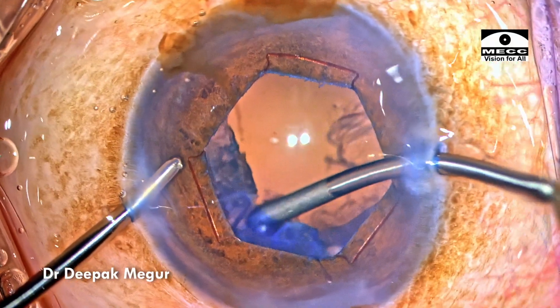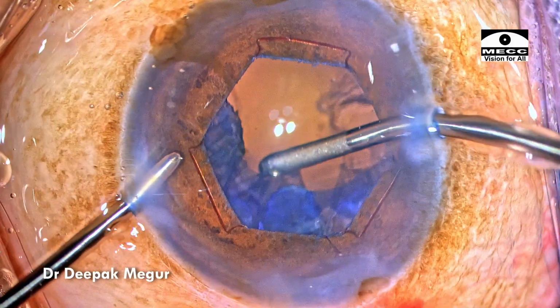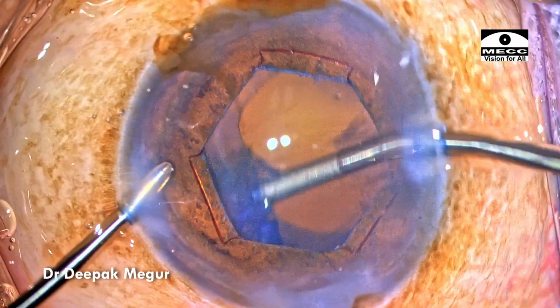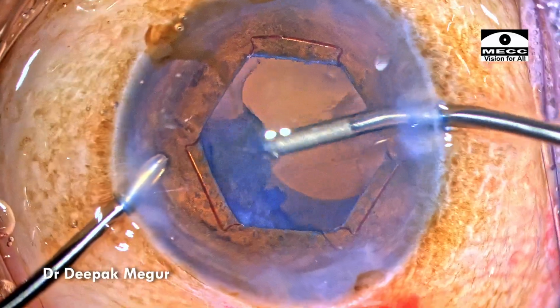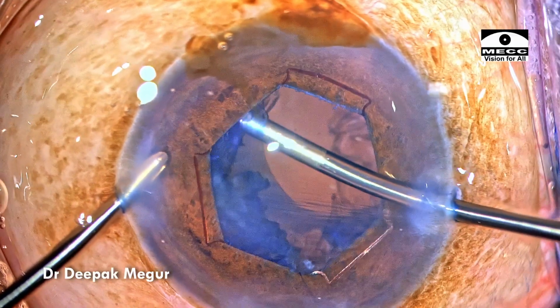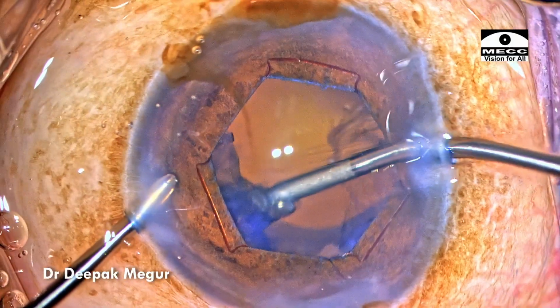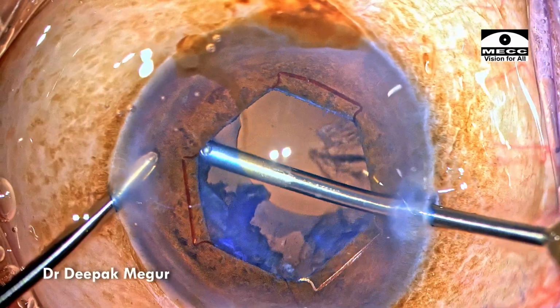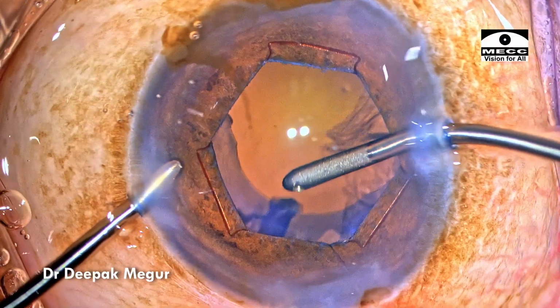In these cases, because the laxity of the zonules is such that we can never achieve a good cortical cleaving hydrodissection, the cortex tends to be very sticky to the capsular bag, and to add on, we also have a CTR inside. But nevertheless, if we are patient enough, and that's the only virtue to have, that's patience, we can tease out all of this cortex one by one. It's going to take a few more minutes, but that's worth it.